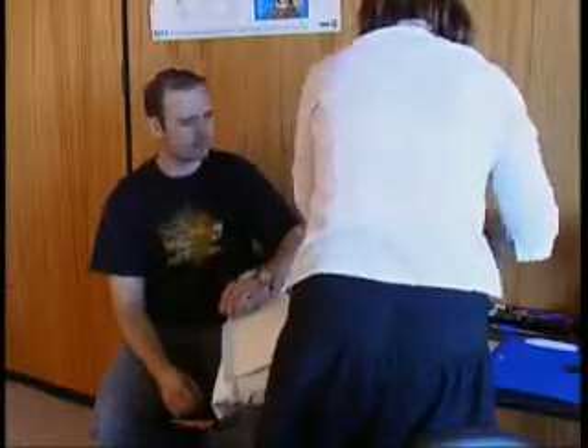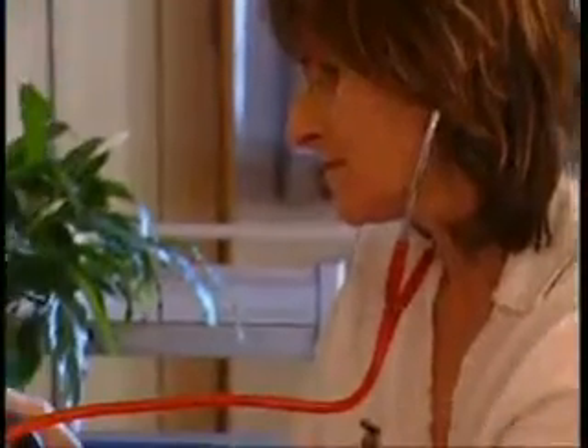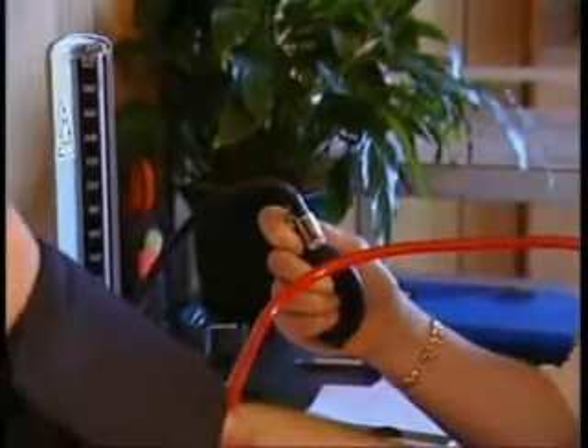Position of client. The client should be sitting or lying in a comfortable and relaxed position, with feet uncrossed. The upper arm should be resting, supported at heart level, and if using a mercury manometer, this should be at your eye level.